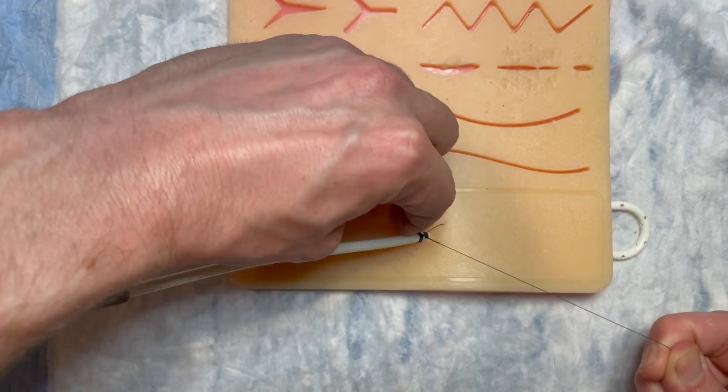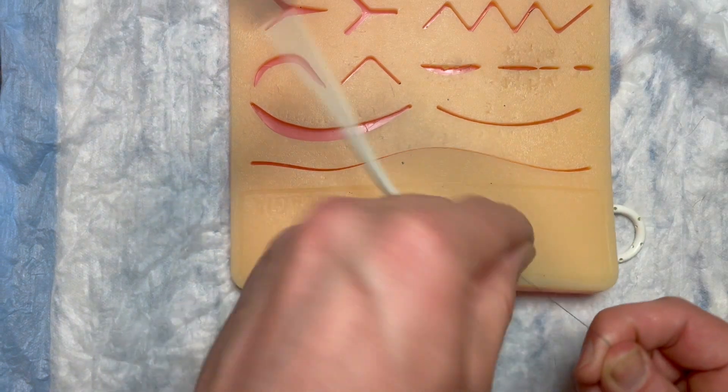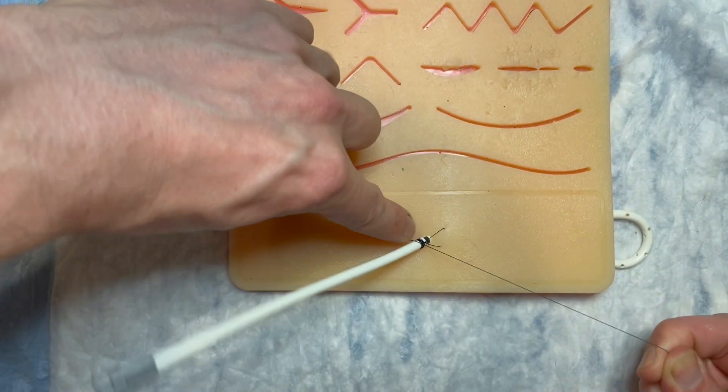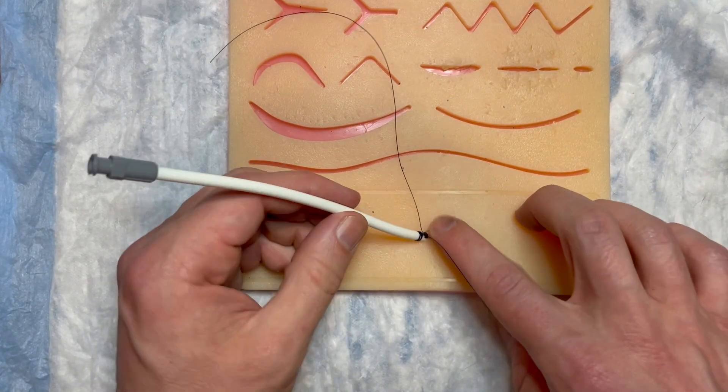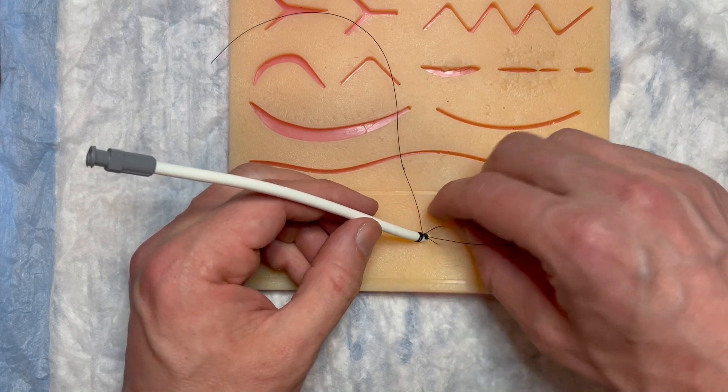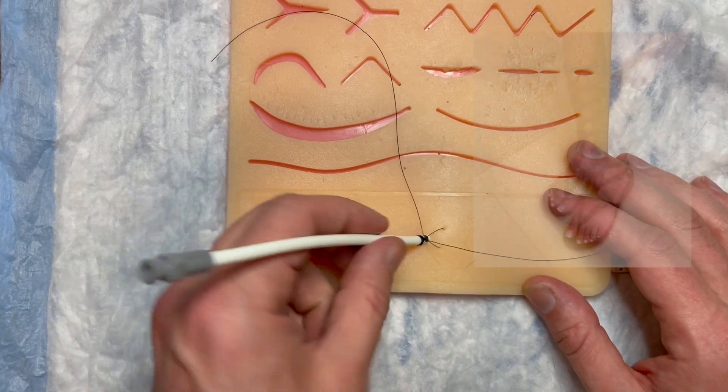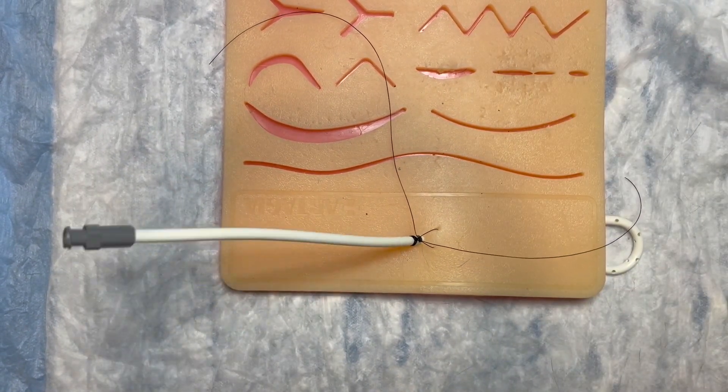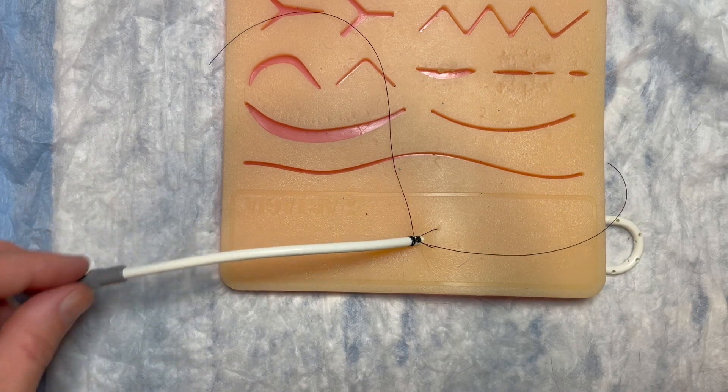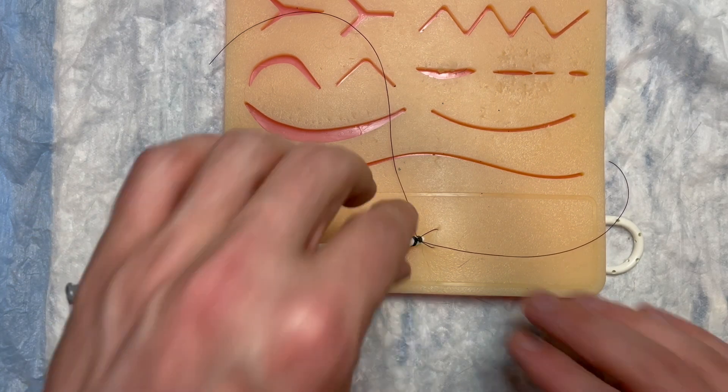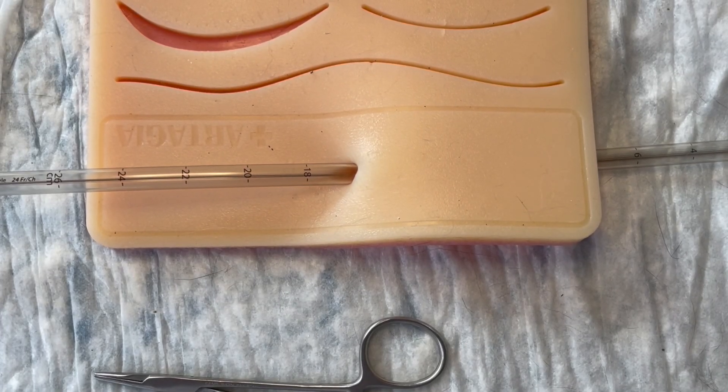And do a few throws there and my final one here. And boom, so I've got a nice little air knot here that's not going to cause any necrosis of the skin and look how secure this is with no Roman sandal technique. So that is how you secure a pigtail catheter, it's not going anywhere.